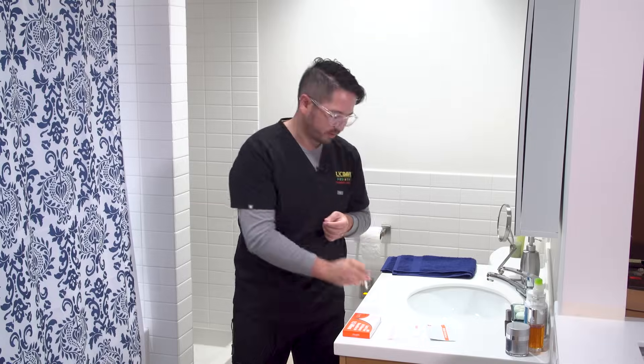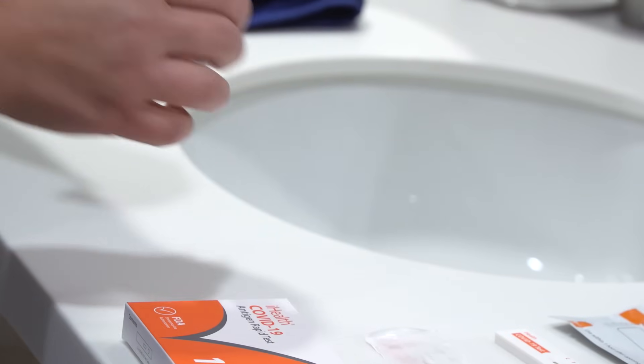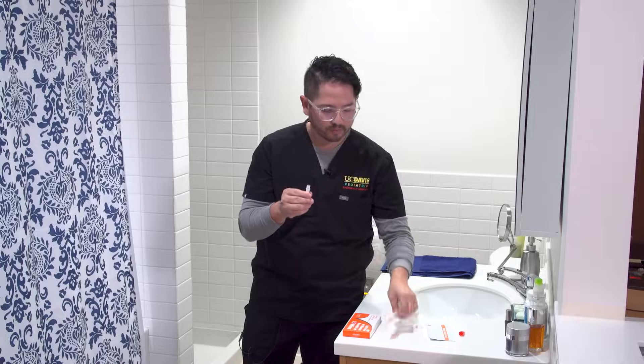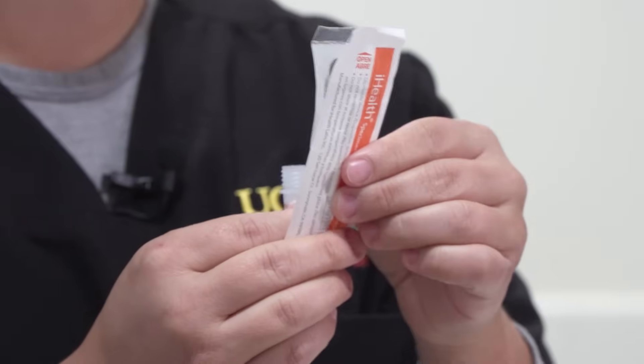The next part we're going to use is the liquid in the dropper. Make sure to tap it three times on a hard surface. One, two, three. You'll go ahead and open up the orange part and set that aside on a clean surface.